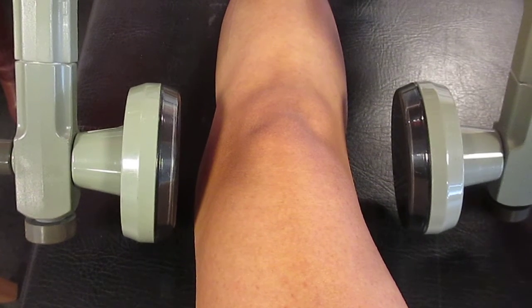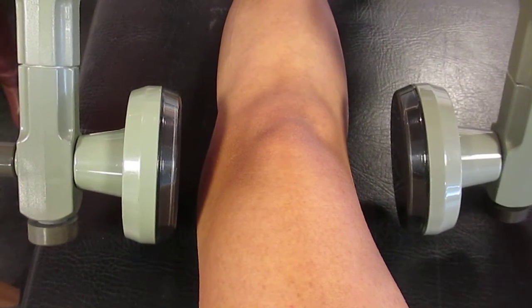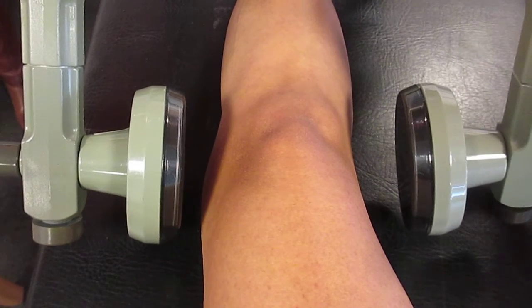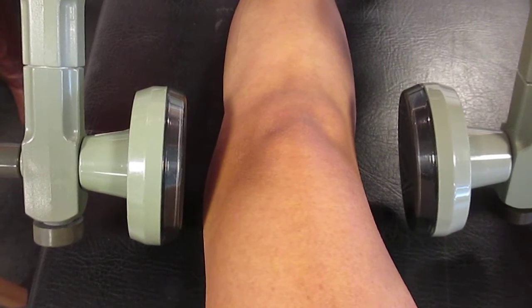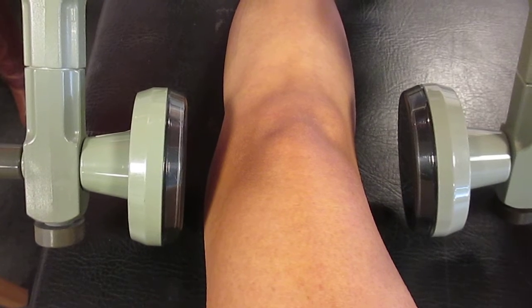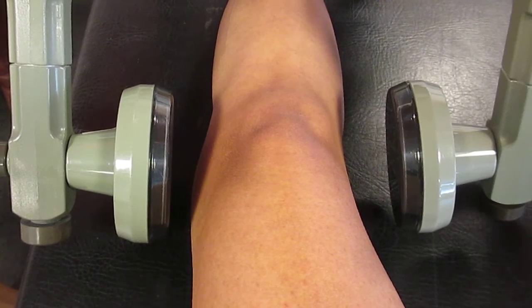Diathermy set up using the Curipulse 419 machine with the electrodes in a contraplanar setting. This setting can be used for acute lesions or chronic lesions that are slightly deeper, where you want to achieve the effect within these deep structures.